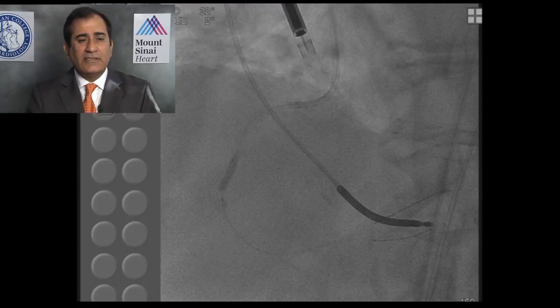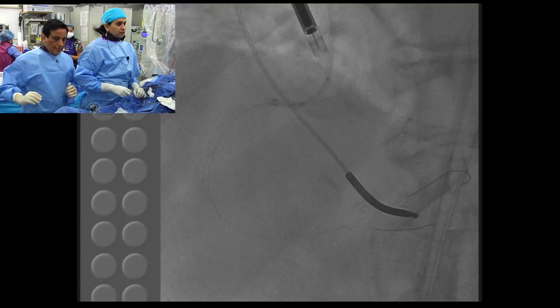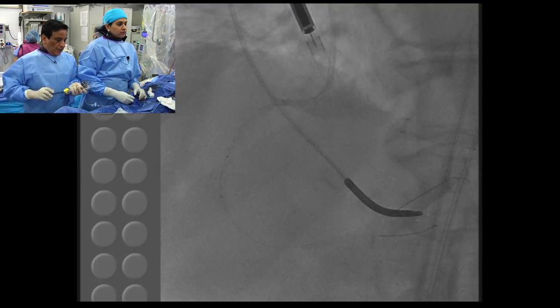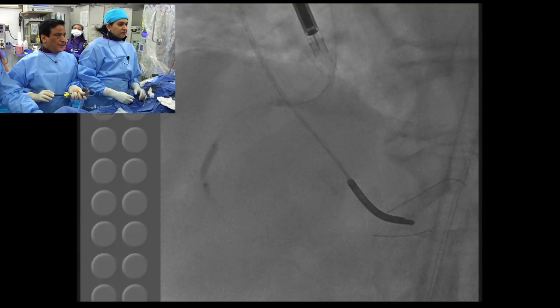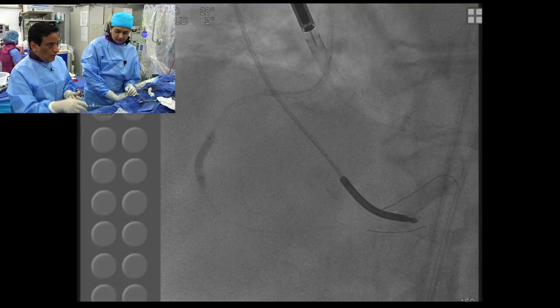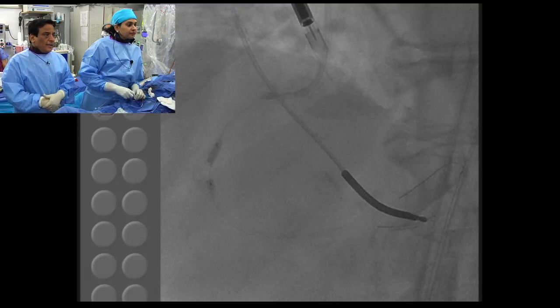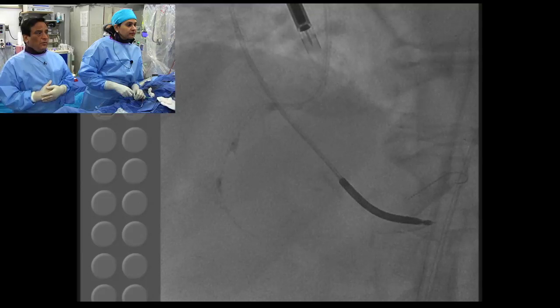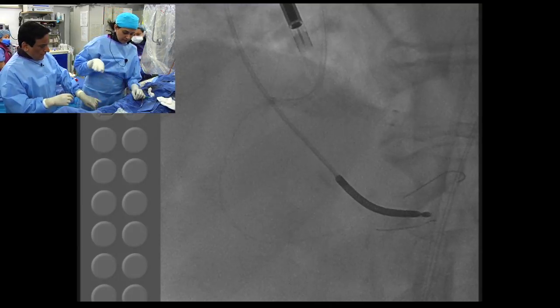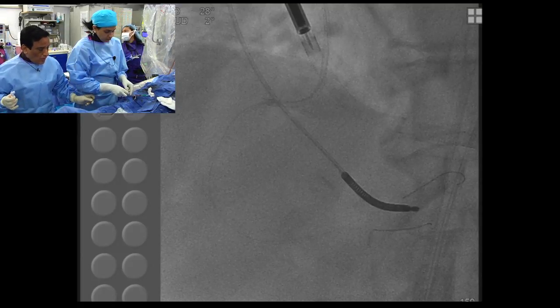Did you have the chance to use it in some cardiogenic shock patients? That's a very interesting question; somebody else asked when I was at a meeting in India. We have not used this Impella in cardiogenic shock at Sinai. We have used it in one or two cases where the patients had cardiomyopathy and severe hypotension while waiting for a transplant. But per se in cardiogenic shock, we have not used it. We have used it in a few cases of cath lab catastrophe, but there has not been a great outcome. And I still don't know that this device truly is going to help in cardiogenic shock, because there is no data at present to support that using the Impella has decreased mortality, or even a signal of decreased mortality. They were supposed to do their own trial, which was aborted.